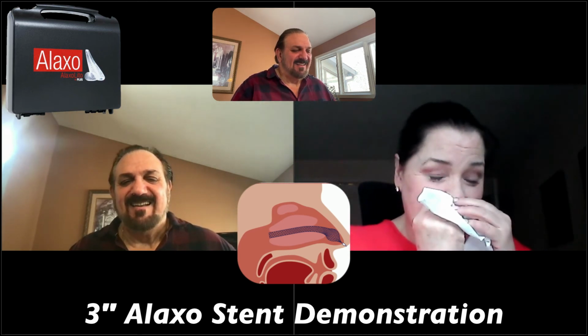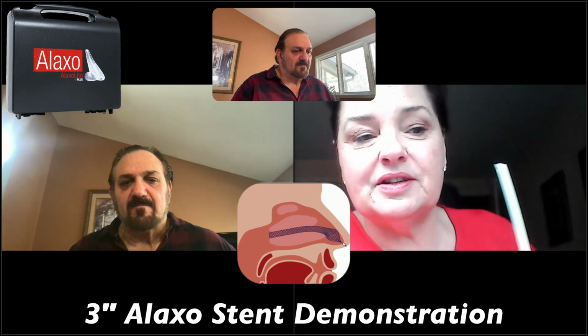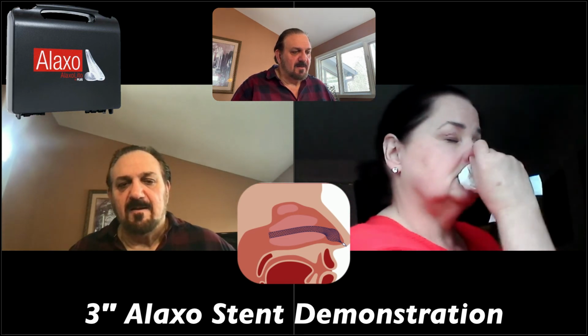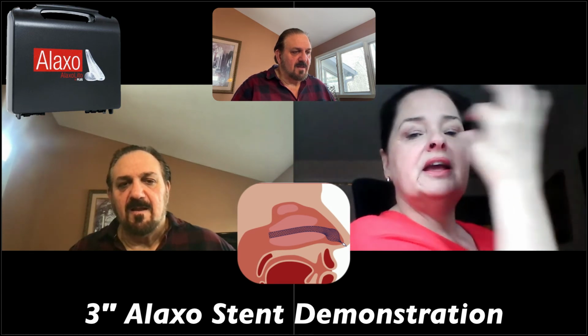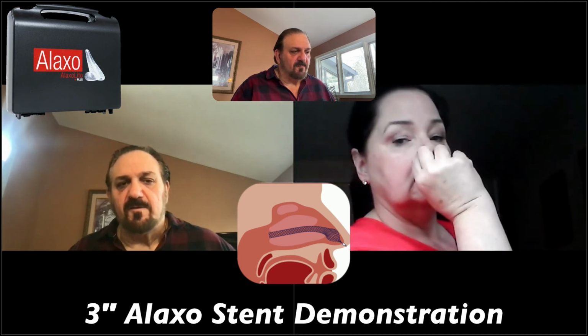So you could just grab this. Some people will use this rod, particularly with the 6-inch, and put it back on and use it to pull out. It's not necessary at all. You just have to grab the silver ball. Right. And I would say slowly, in one movement. It's nicer if you go in one slow movement instead of jerking it. I'll watch you first before I do that.